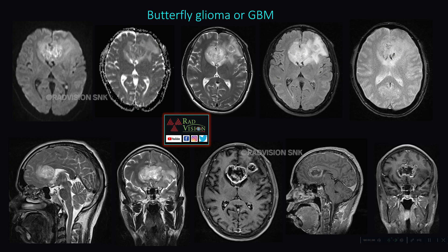Another type of glioblastoma multiforme commonly encountered is butterfly glioma GBM. Here the lesion is noted in the genu of the corpus callosum extending along the corpus callosum into the frontal lobes in a butterfly fashion, showing patchy restricted diffusion on DWI, hyperintense on T2 and FLAIR, with focal blooming on GRE suggestive of hemorrhage. On IV contrast, there is typically peripheral thick irregular rind enhancement with central necrosis — a case of butterfly glioma.